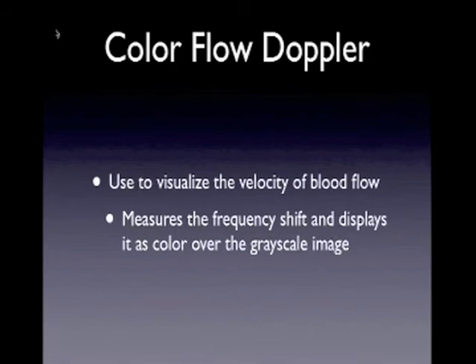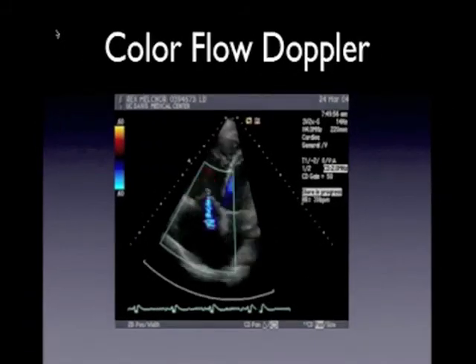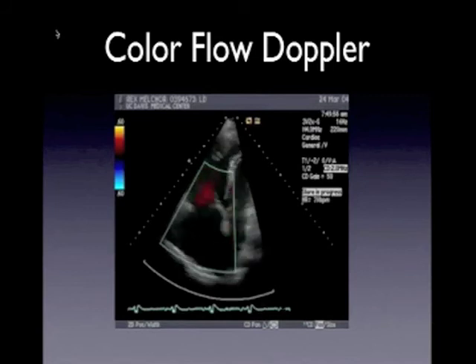Color Doppler is a technique for visualizing the velocity of blood, otherwise known as speed and direction of blood, within an image plane. To measure the velocity of blood, sound waves are transmitted into a vessel or through a valve, and the sound that is reflected from the blood is detected. Because blood is moving, the sound undergoes a frequency or Doppler shift. A color Doppler function measures the Doppler shifts. The way in which the frequency shifts are encoded is defined by the color bar highlighted in yellow.